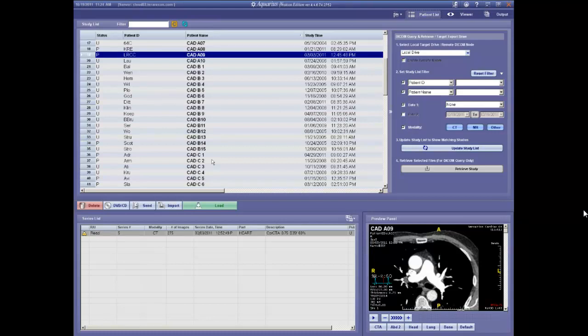It's an inexpensive test, tells you stamina and tells you the unique characteristics of that particular patient that might otherwise be later misinterpreted. But actually, the problem is that plaque can grow and can change, and so I don't really know what your confidence interval is if things are going to stay absolutely the same. So you wouldn't want to draw too much confidence from the CT information or the stress test information that you get. So I think it would have debatable value.